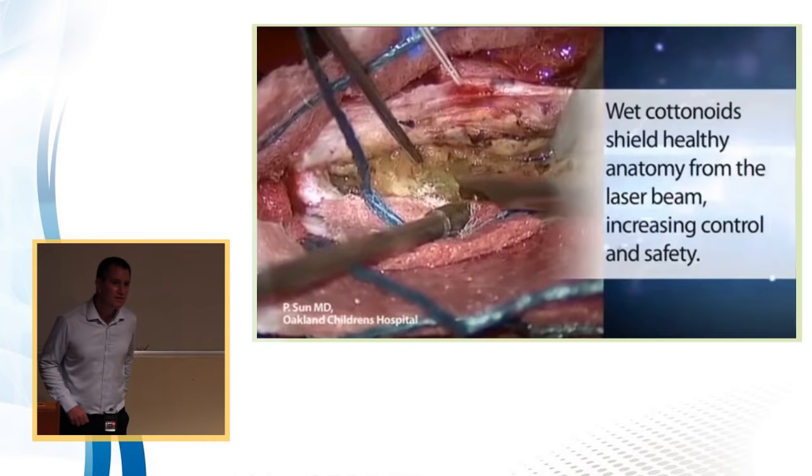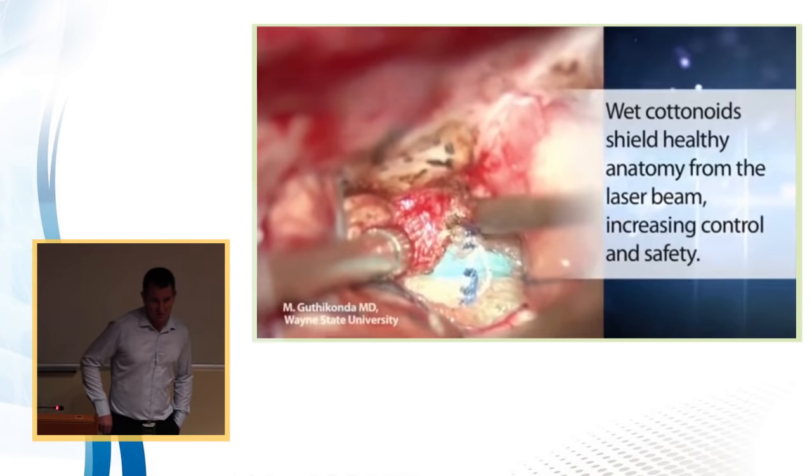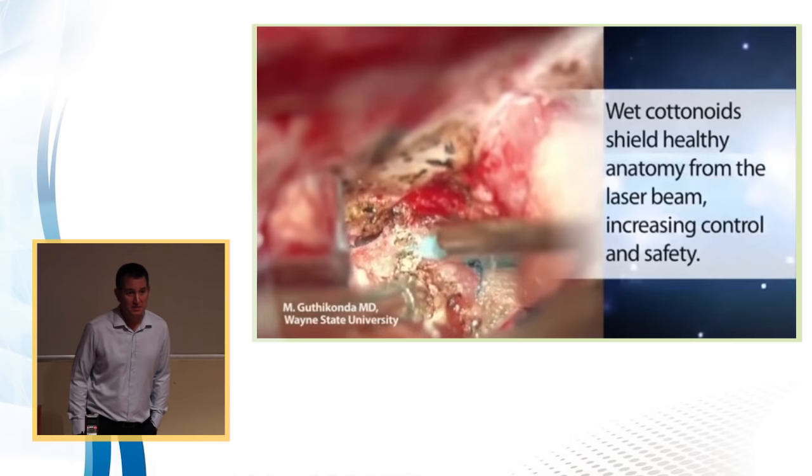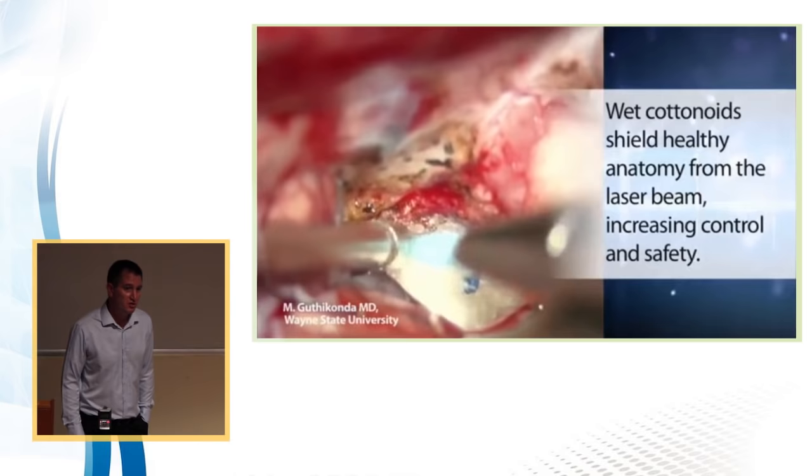It very much depends on the application. It's not in the picosecond regime. It's much longer. It depends on how you use it. For example, if it's coagulation, it's a relatively long pulse, which can be milliseconds. If it's for ablation, it's much less, around microseconds, 10 microseconds.